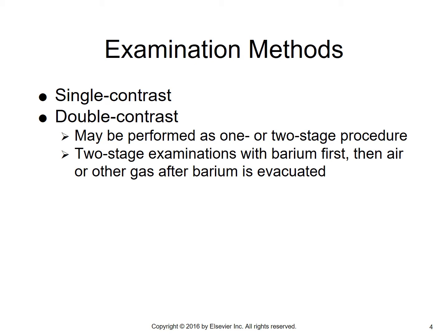Two-stage examinations involve using the barium first, and then air or another gas like CO2 would be inserted after the barium then is evacuated.